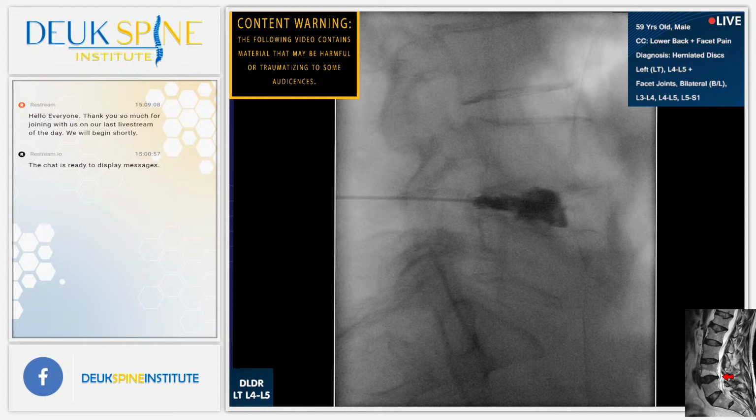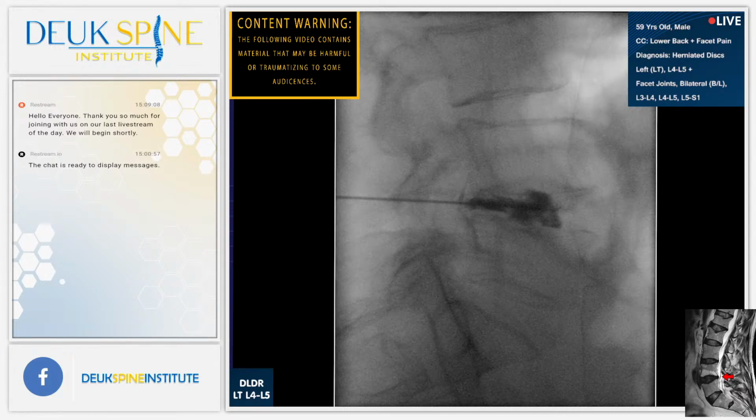Shot. All right, at this point, we know. Jordan, show us on the x-ray where the tear is that's causing his pain. Can you guys see the tear? It's beautiful. Yes, we can. Right there. Show us the center of the disc, Jordan, where we injected the dye. Circle it. It's much bigger than that, Jordan. It's that whole black area. Yeah. Now show us where the tear starts. Yes, and where it ends. Yes. A little further. There. So that tear is around 2.5, 3 centimeters long. That's what we're here to fix. That's where his pain is coming from.